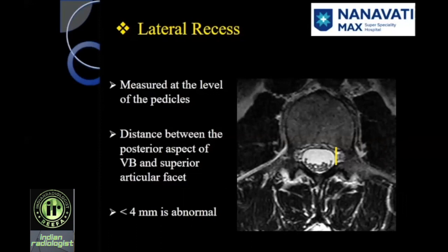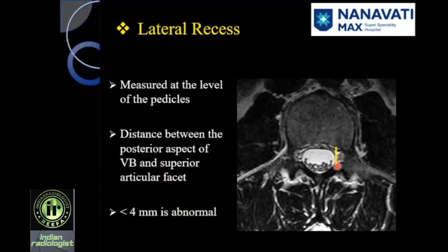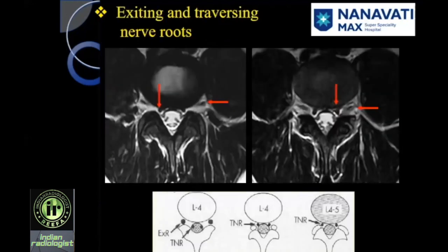A little bit about lateral recess stenosis. When we talk about lateral recess stenosis, this is the distance measured between the posterior aspect of the vertebral body — L4 here — and the superior articular facet of L5. This distance is measured just outside the margin of the thecal sac, at the level of the undersurface of the pedicle. Anything less than 4 mm at this juncture is abnormal. When you have a diameter of 2 or 3 mm, it will be called lateral recess stenosis. 4 mm or more is normal.